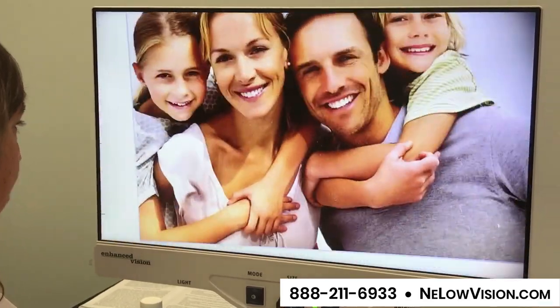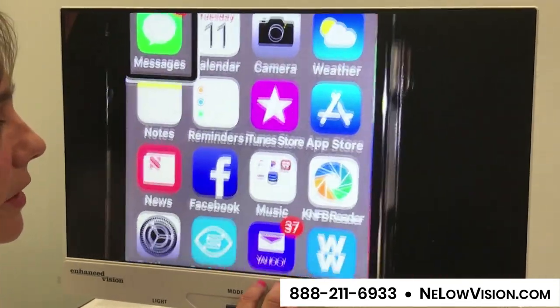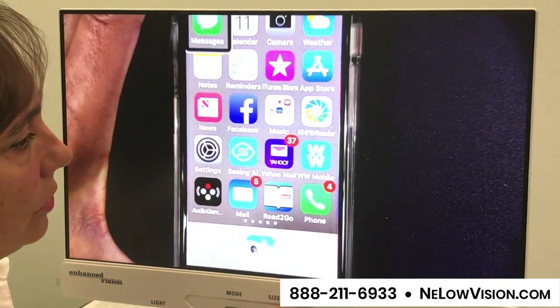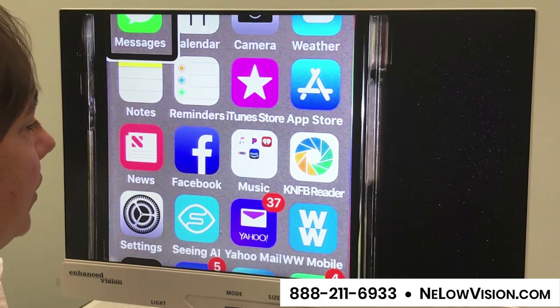We can even pop a cell phone underneath here. Say the kids come over and want to show you some pictures, or you just want to easily see the icons on your iPhone — you can do that or your iPad. A lot of us now are using those in our homes, especially with low vision.